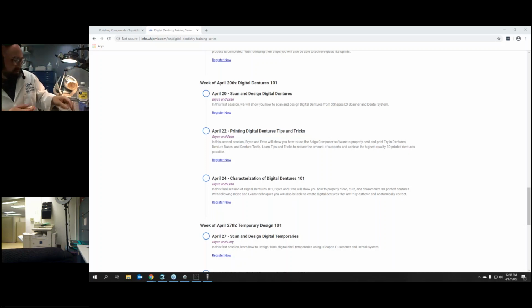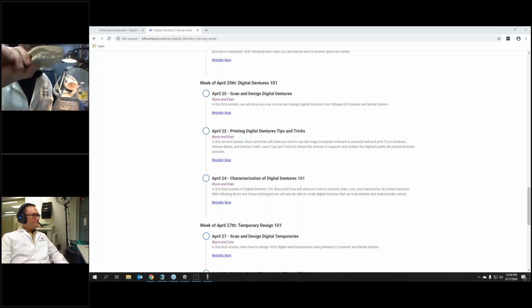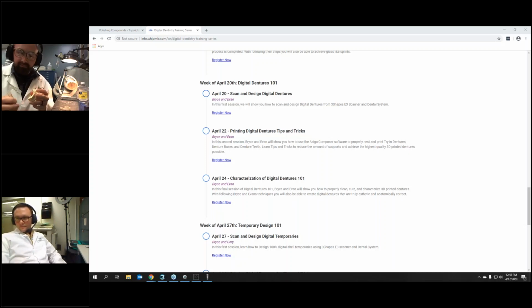And then here's the model that we scanned in. Oh, that's perfect. That's good. Yeah. So you can see all the way around, kind of hard to see with the background we have. Maybe if I moved out of the light, you can see it's fit all the way around. So it looks like it was designed a little off the post here. I would have probably gone around a little bit, the height of contour there, next time. But yeah.